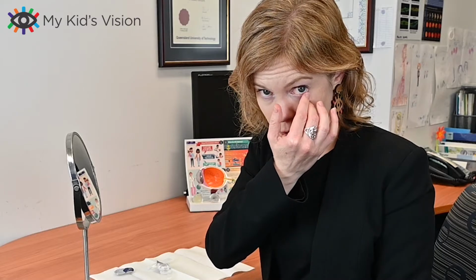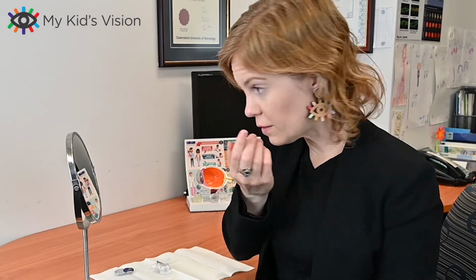So make sure when you slide down that you slide down, keep your finger there, bring your thumb in and pinch it off. And if you keep looking at yourself in the mirror, you are only going to touch the contact lens. You won't pinch your eye or pinch your eyelashes or anything like that. It takes a little bit to master, but once you've done it 5 or 6 times, it gets a whole lot easier to do.